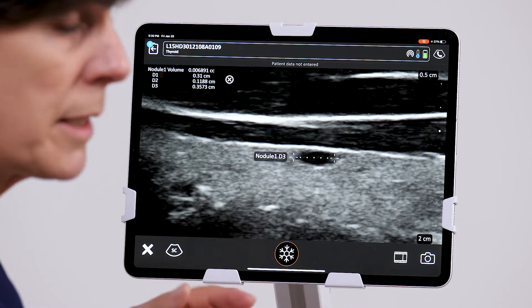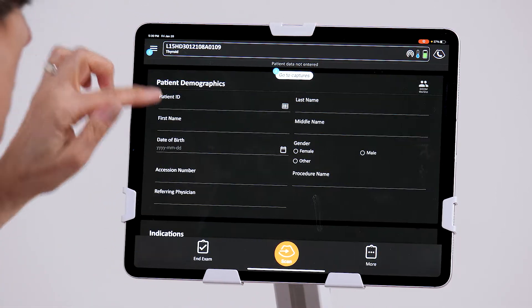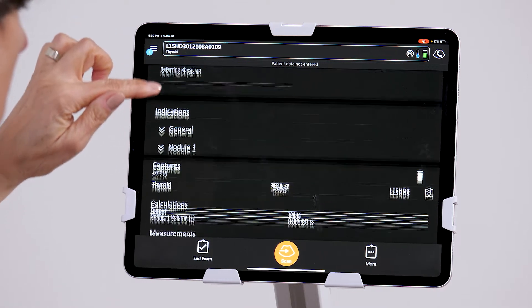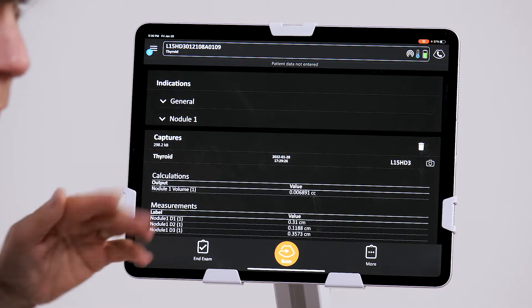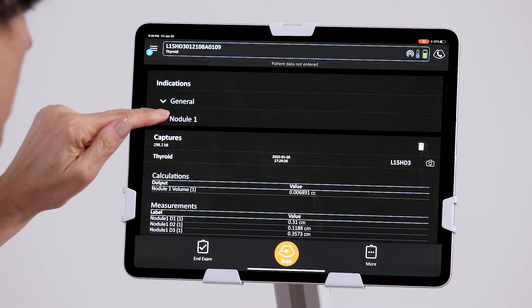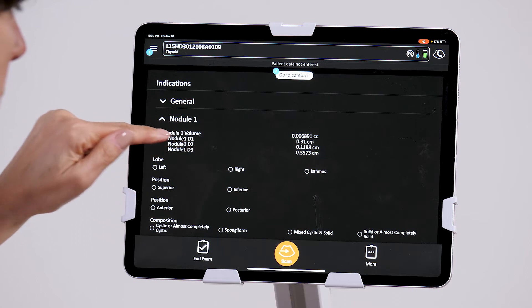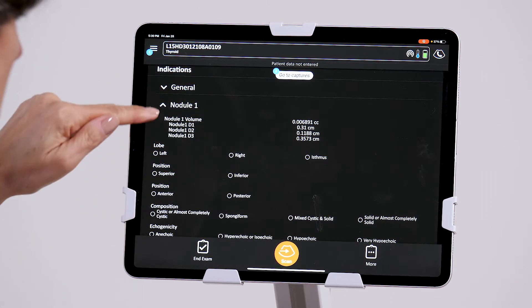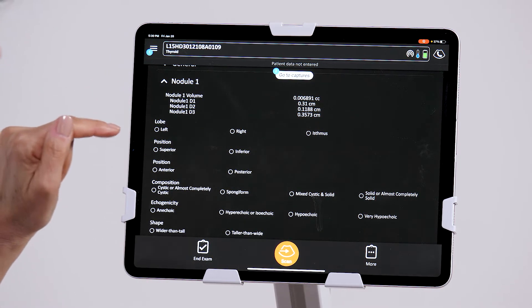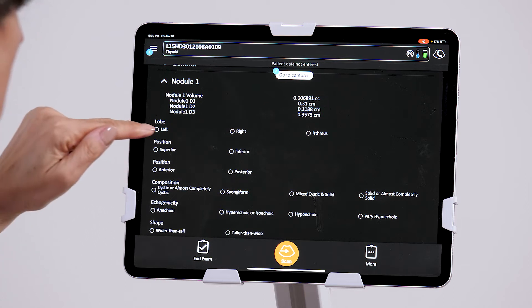So we're complete with our measurements. I'm going to go to the report page, where I can add more information about the nodule. With the drop-down window, I can see measurements of the nodule here, but I can also characterize it according to the TYRADS workflow.